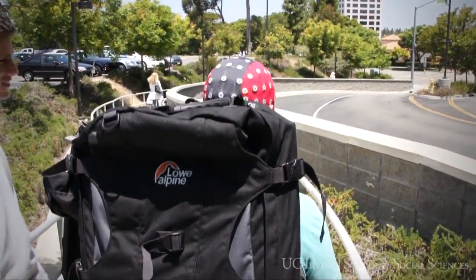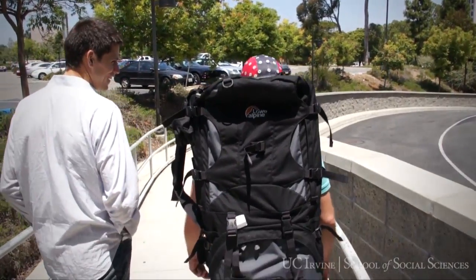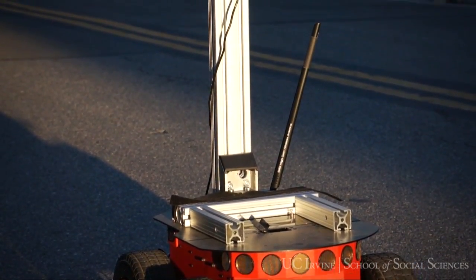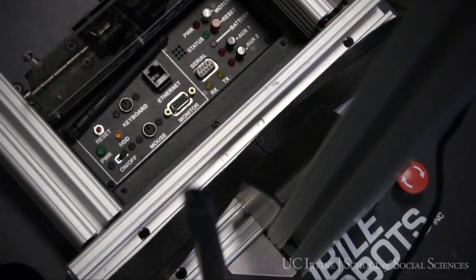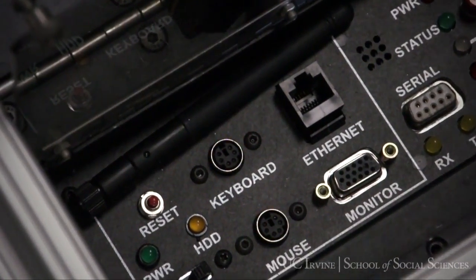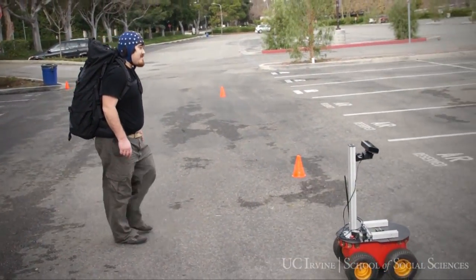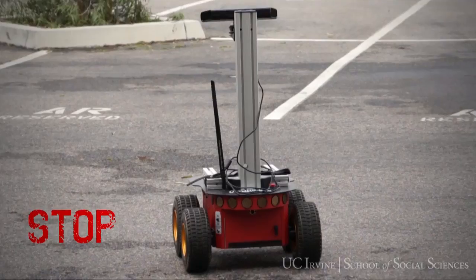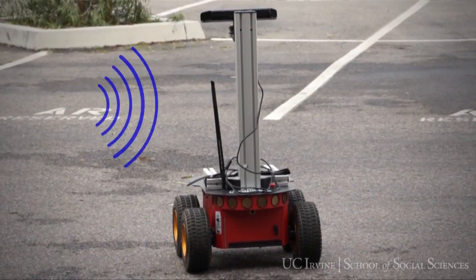A brain-computer interface uses the results of this signal processing for communication and control. Signal processing by the notebook computer inside the EEG backpack is used to control robot movement. The robot that we use in this research is a P3AT robot made by MobileRobots. This robot has an onboard computer that is wirelessly connected to the EEG signal processing computer. The end result of this processing is the generation of movement commands like turn left, turn right, go forward, or stop. These commands are then sent via wireless network to the robot, which carries out the commands.